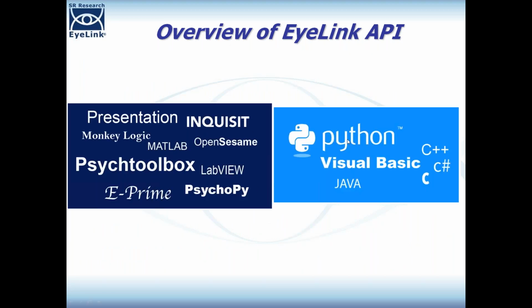Here's a list, and I'm not even sure if it's totally exhaustive of everything that you can use, but it has a lot of the different programming environments that can access and use the EyeLink API. So you can see there are quite a lot of options here. And again, you can get more information about these on our website.